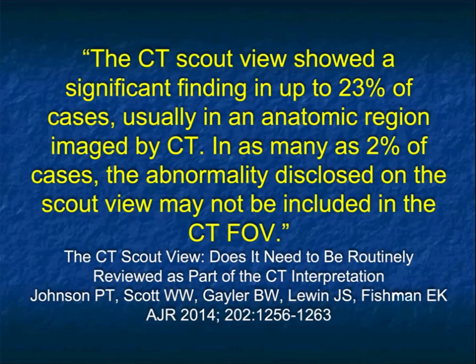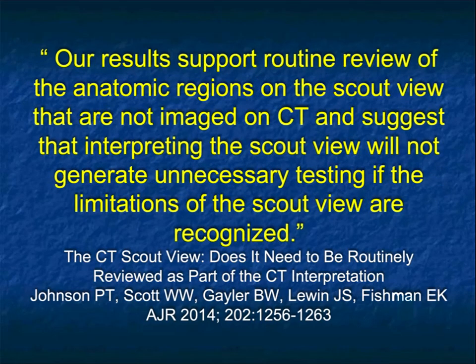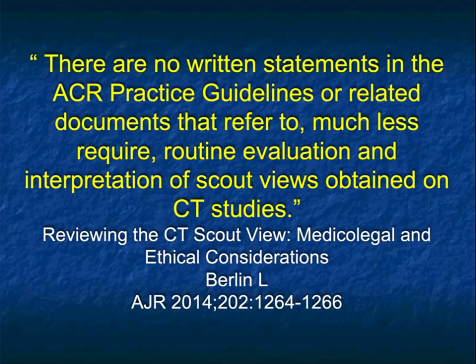Maybe you see something in the extremities that's cut off the field of view. There are many different reasons. And so this article by Pam Johnson suggested that interpreting the scout view is important. There was some concern perhaps it would lead to unnecessary studies, but that was felt not to be the case.